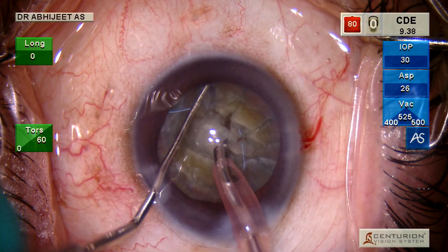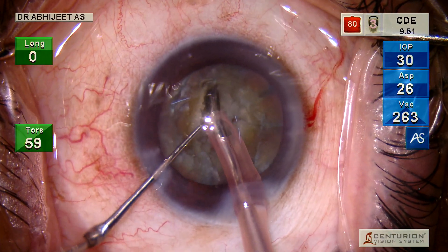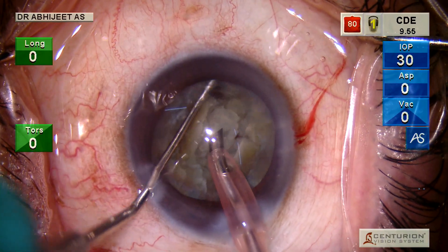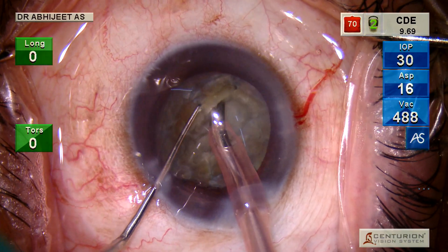You need to make multiple small pieces, because the smaller the pieces, the lesser the energy used for emulsifying each individual piece.